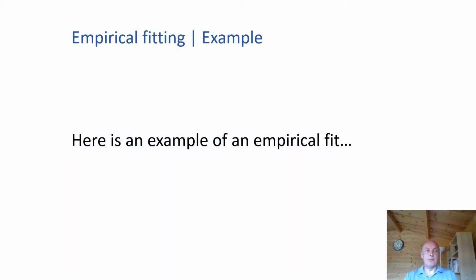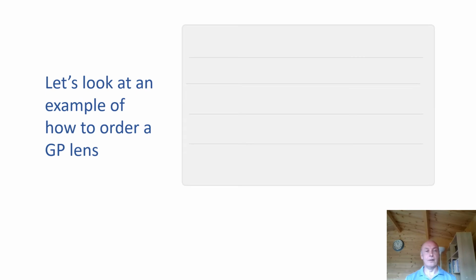So as we saw from the previous course, most contact lens fitting now, for gas permeables certainly, is done empirically. So what we thought we'd do is give you an example of an empirical fit, so you can work through the numbers and see exactly how we arrive at the lens specifications.